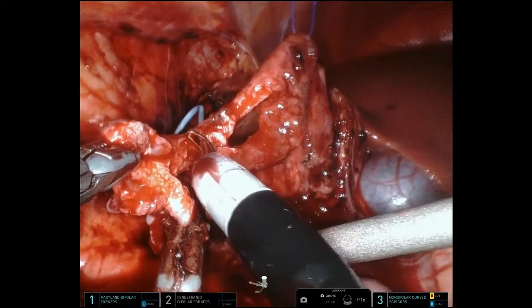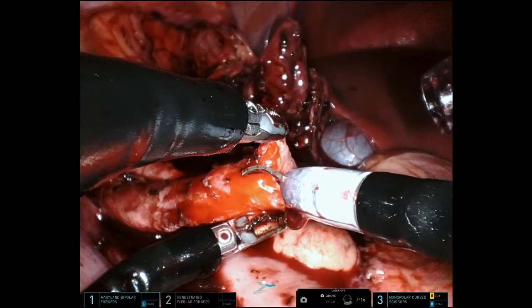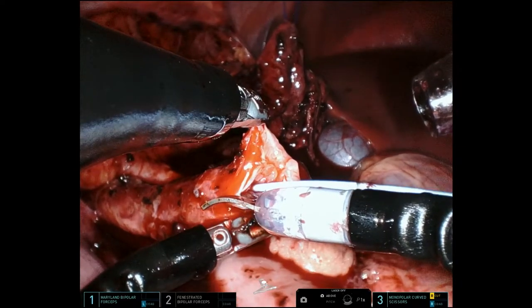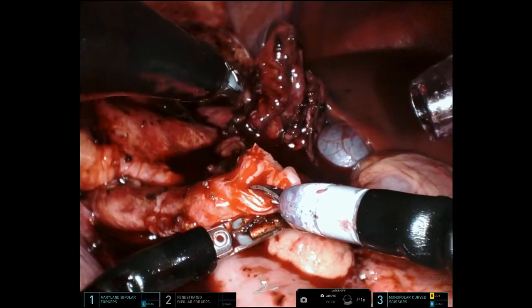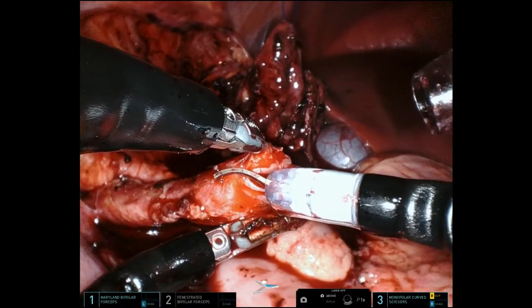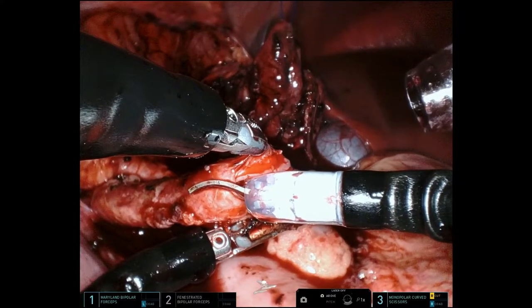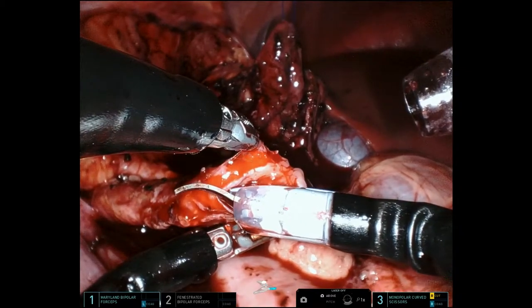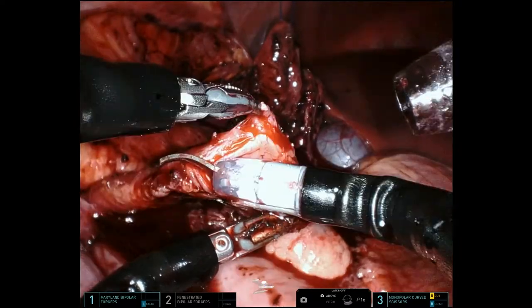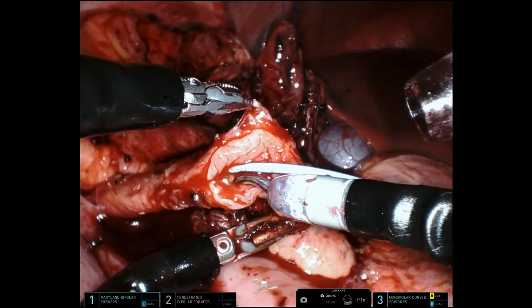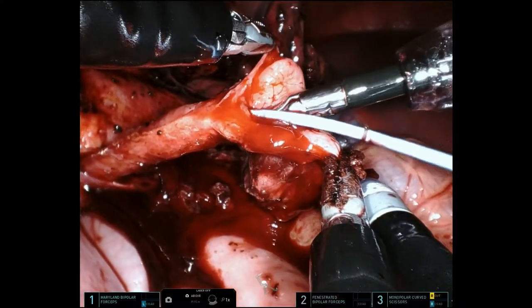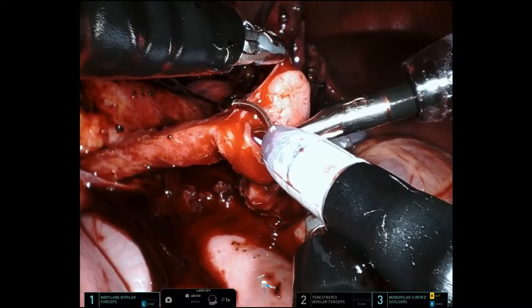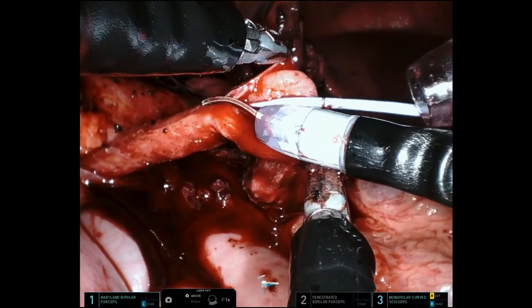This was passed off and discarded. Now we're spatulating the proximal aspect of the ureter, cutting through the strictured segment to a portion of the ureter that appears normal and healthy. I had to spatulate this for some distance to be able to reach healthy tissue. This is bringing in a 5mm laparoscopic Maryland instrument that I'm directing down the ureter, just to be certain that this area of the ureter is widely open with no other strictured tissue.